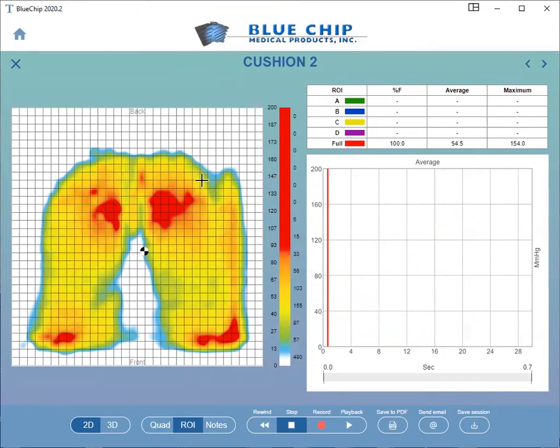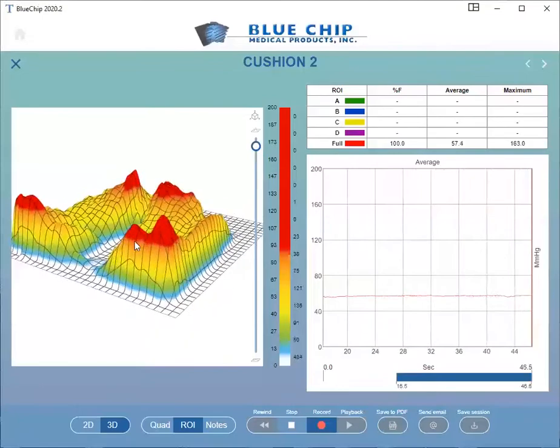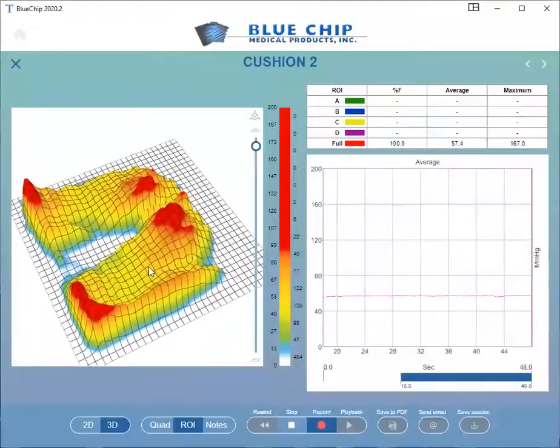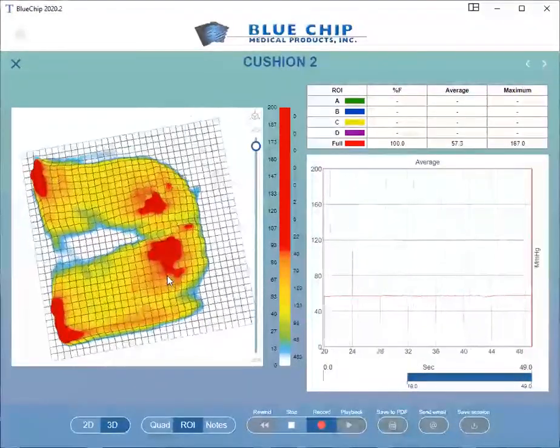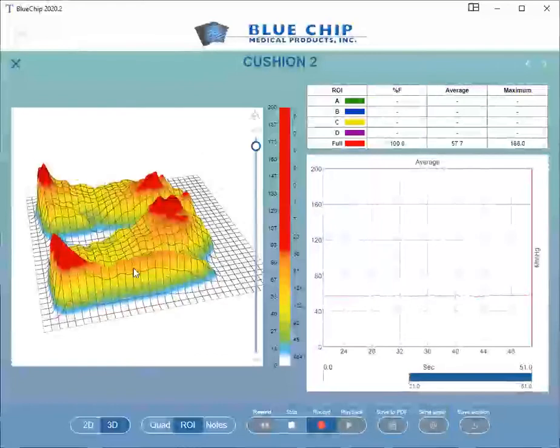Click on the 3D button at the bottom of the screen to switch to 3D view. Clicking and dragging on the Pressure Map image will allow you to rotate in a 3D space.